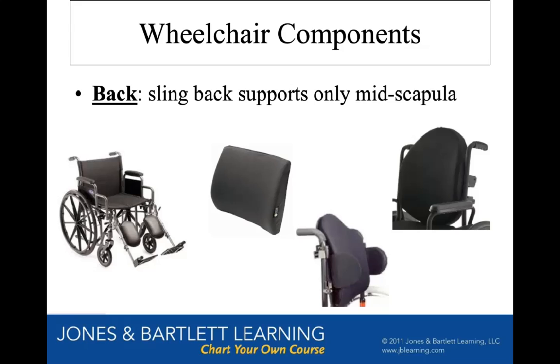And this is like a true backrest that you would want if you're in a wheelchair. Whether you have trunk weakness or not, this gives your trunk a little bit more support, so that you have more support while you're propelling or while you're moving across the ground. And even if you're in a manual wheelchair, you need a custom back, because if you're going across a sidewalk or a driveway or uneven ground, you need something to hold your trunk in place. So you need a custom back.